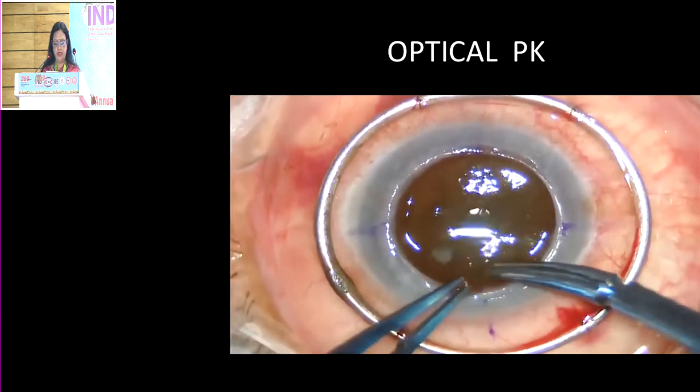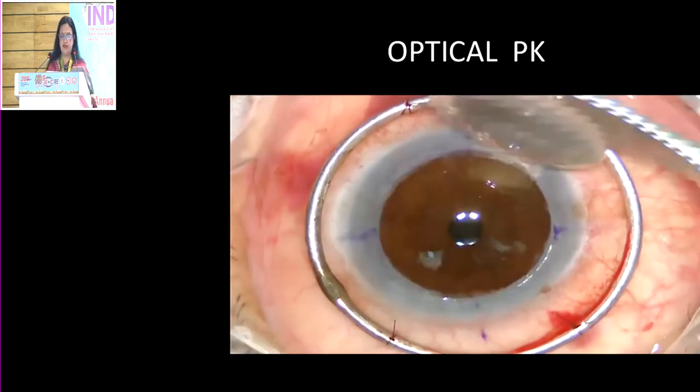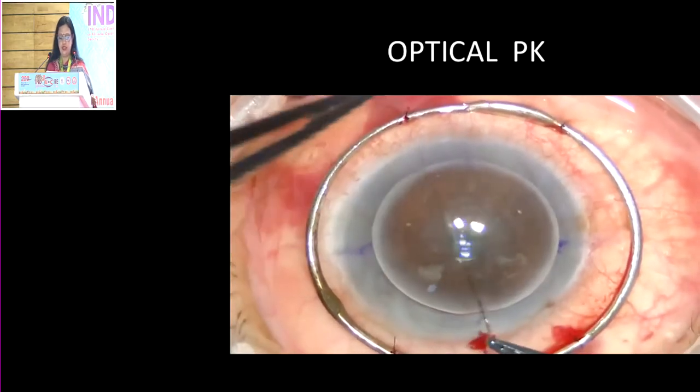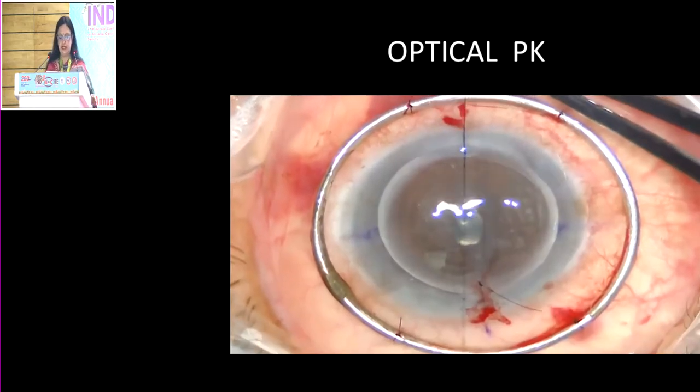Normally I do a peripheral iridectomy (PI) in these cases — you can do an inferior PI so that if a patient's graft fails, you can then do a DSEK on these patients. This is actually a very clean case, but the patient was very old so we decided to do a PK. Otherwise, even a DSEK could have been done for this patient.